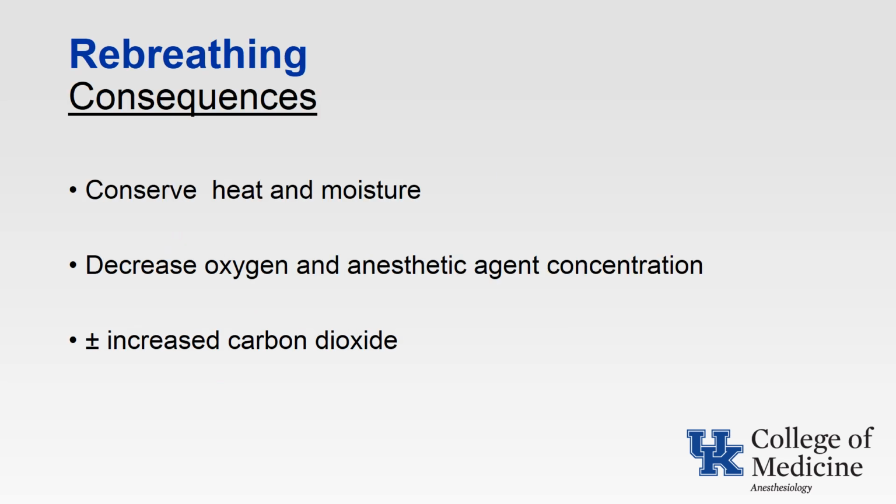The consequences of rebreathing is it conserves heat and moisture, it decreases oxygen and anesthetic concentrations, and it may increase CO2.